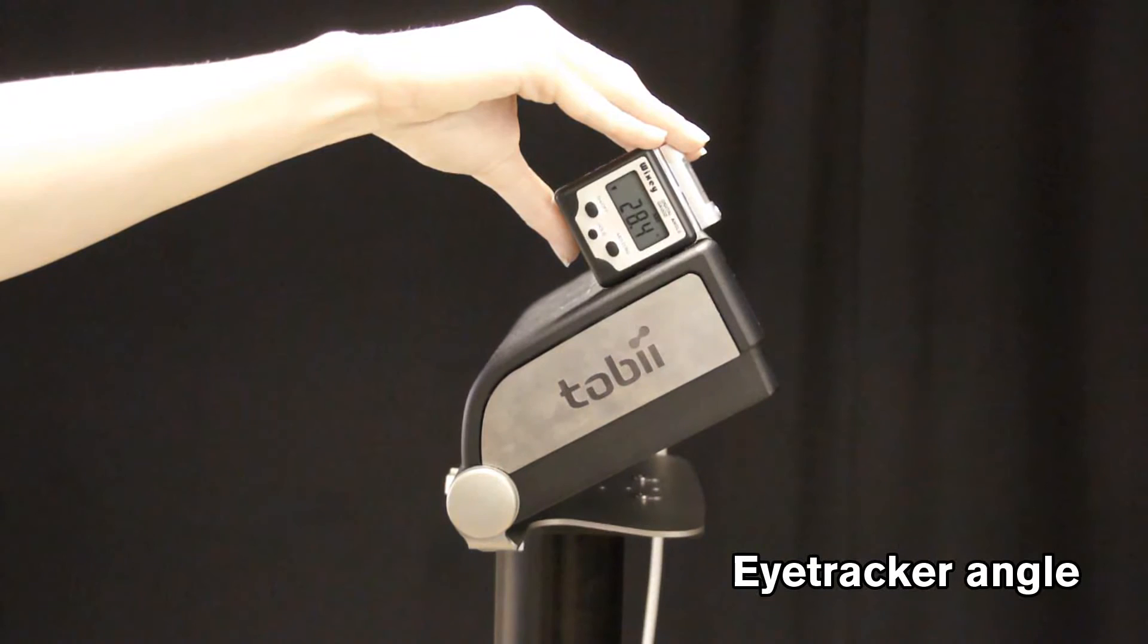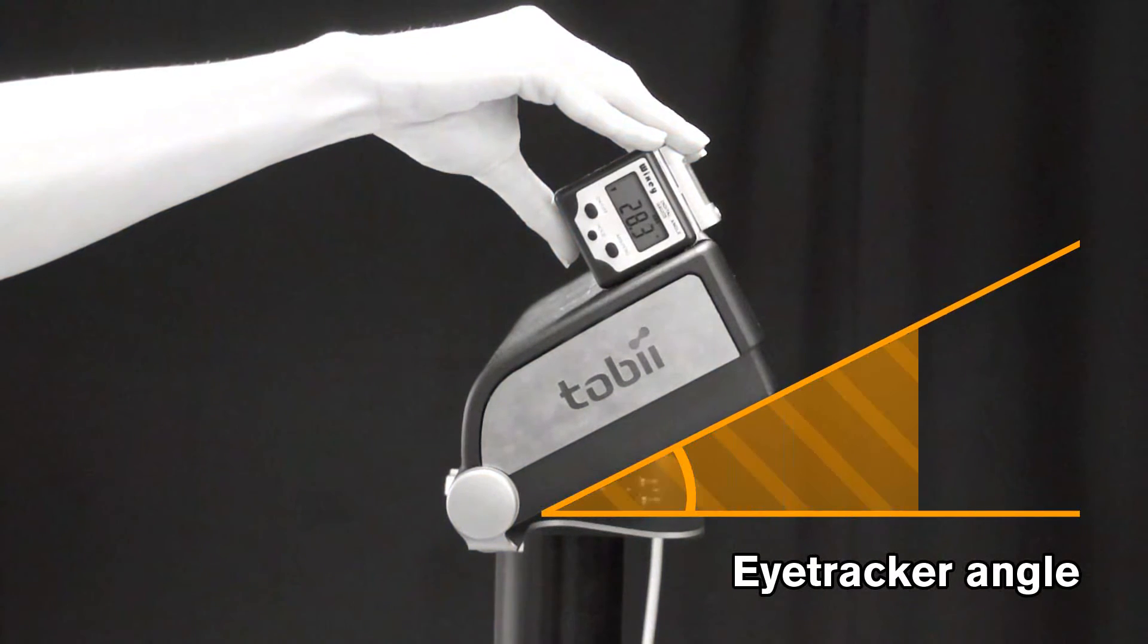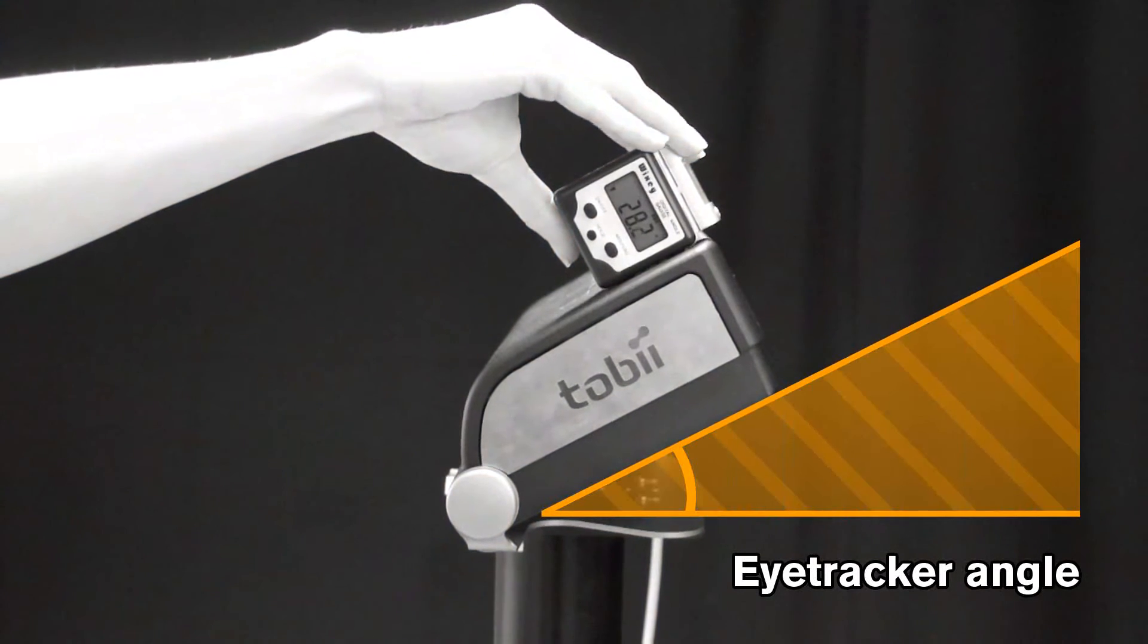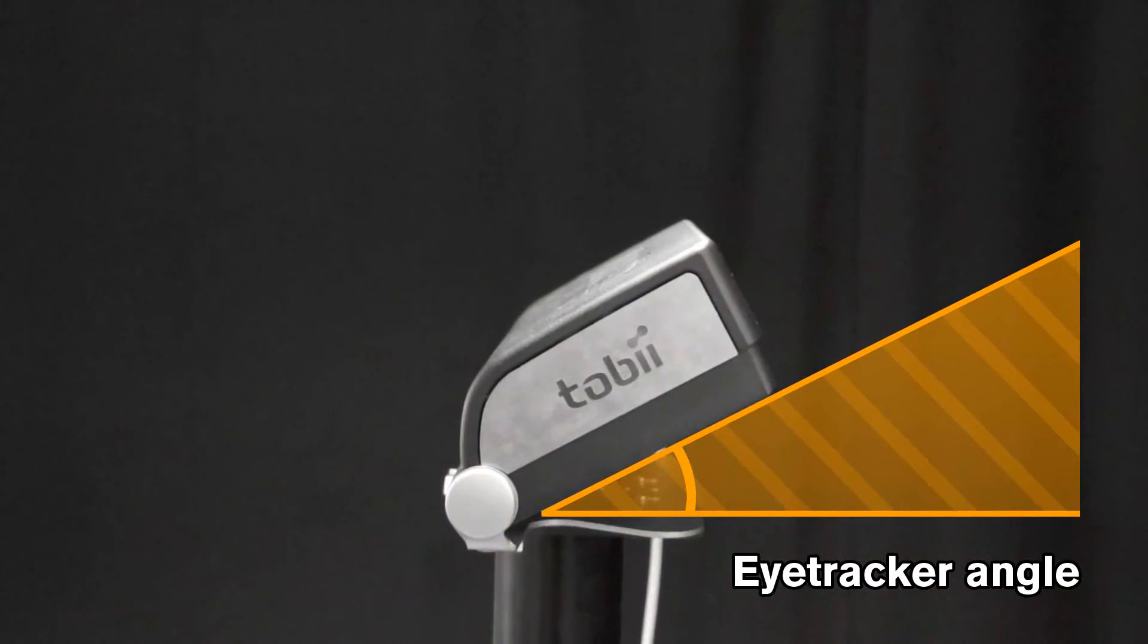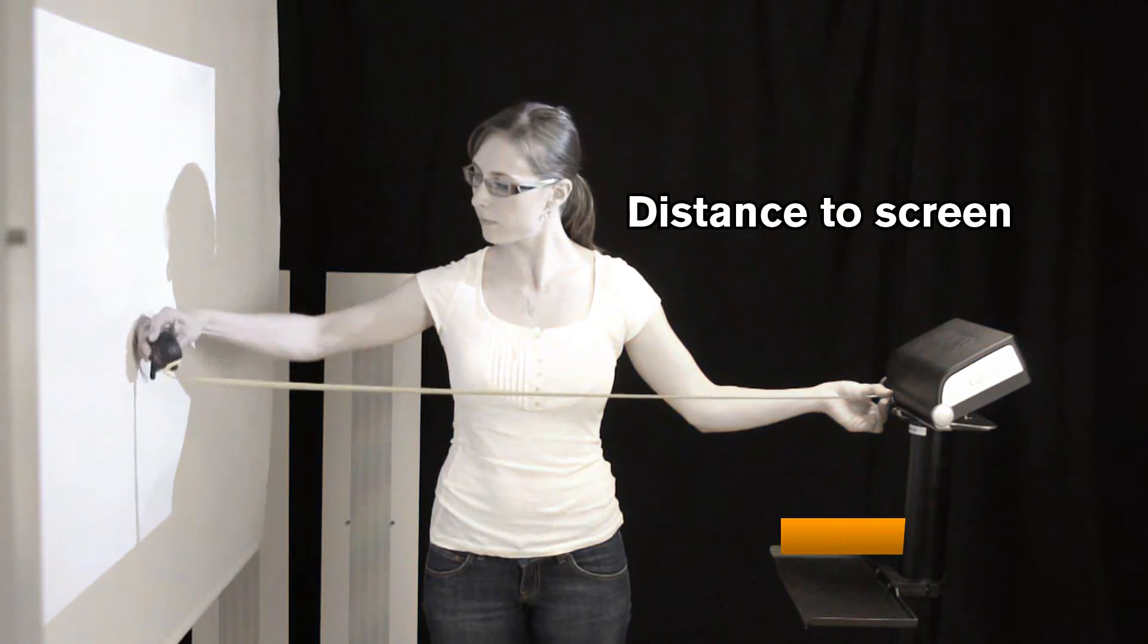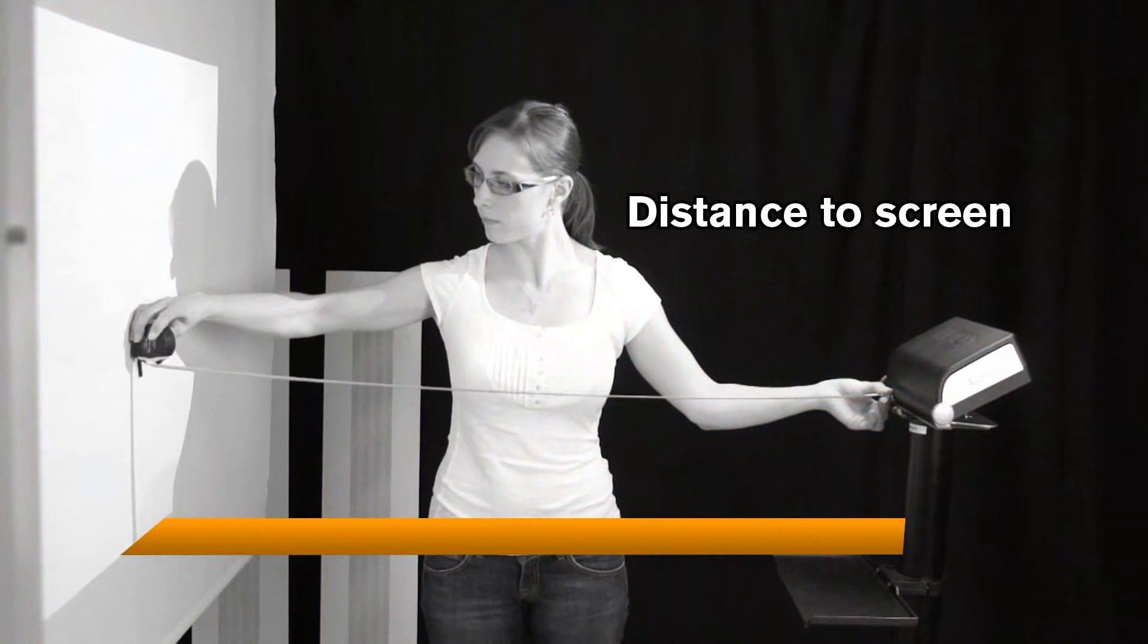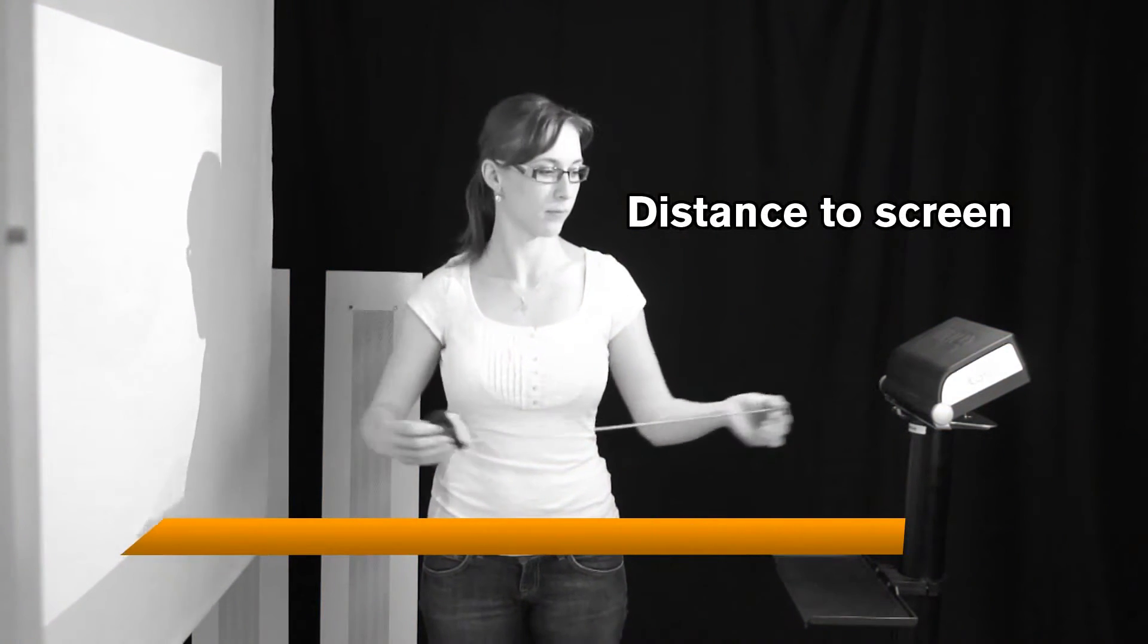Eye tracker angle: Measure the exact angle between the horizontal plane and the eye tracker. Distance to screen: Measure the distance from the back edge of the eye tracker foot to the front of the active display.